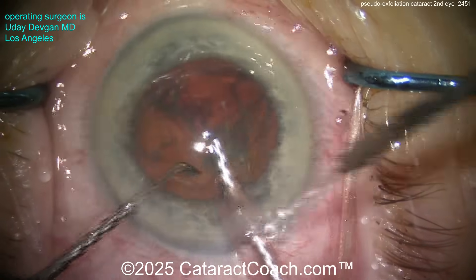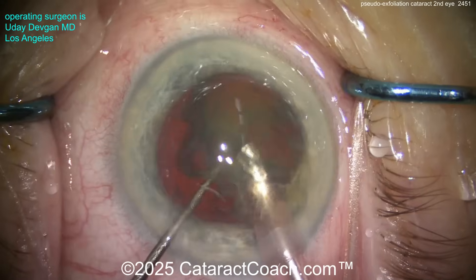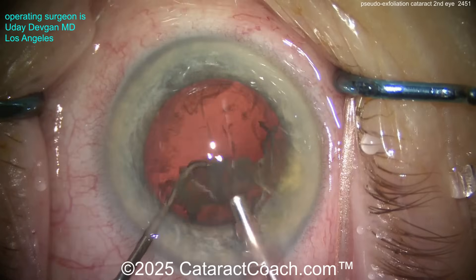Rotating around — there's one half of the nucleus in the bag. Bring that half up. We can then further chop it, or maybe just emulsify — it doesn't even look that dense. By the way, eye is in primary, that looks pretty good. It is in focus. Good draping.